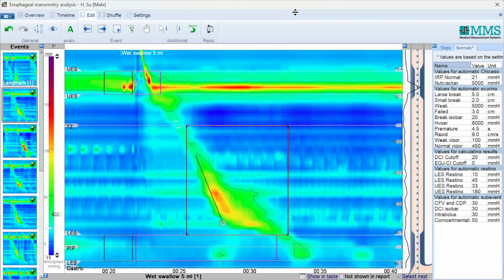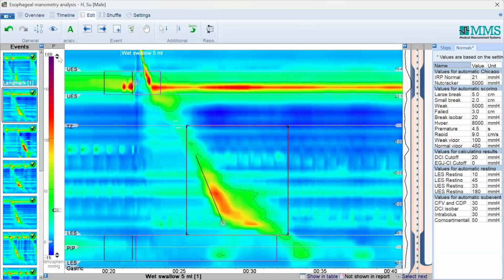You mentioned the green part on top with the slightly reddish in the middle. For people who do not understand this, it's important to say that the color indicates the pressure. The darker the color, the warmer it is, the higher the pressure, right? Yes, that's totally right. This one is the scale of the pressure. It's good that you asked for this one.